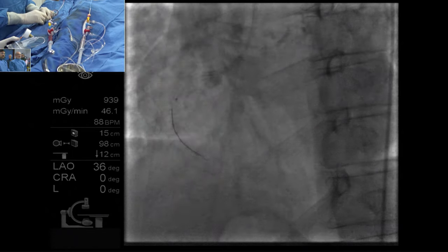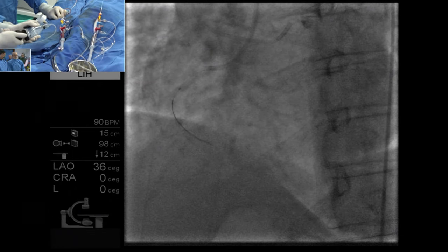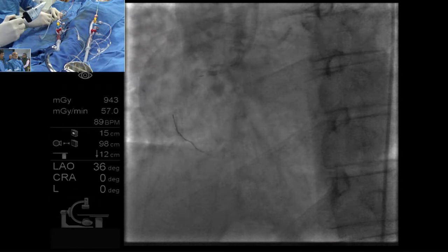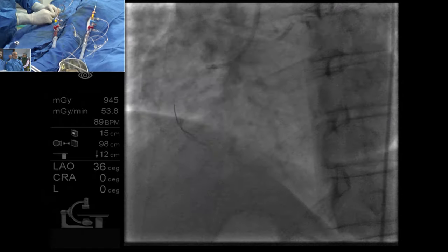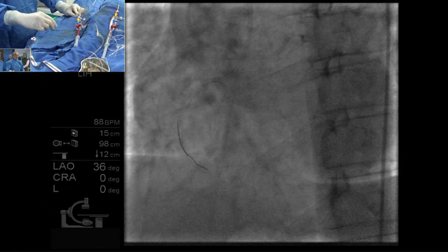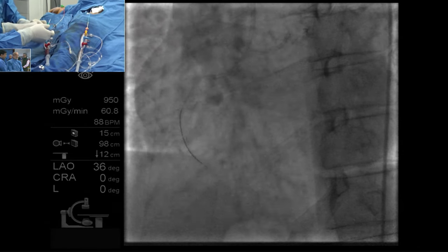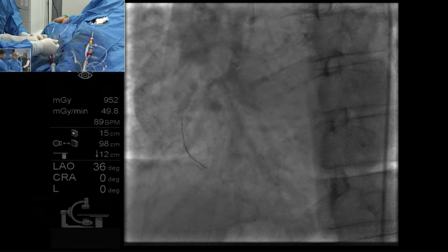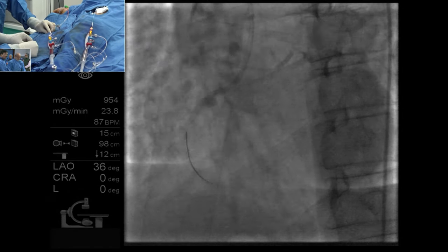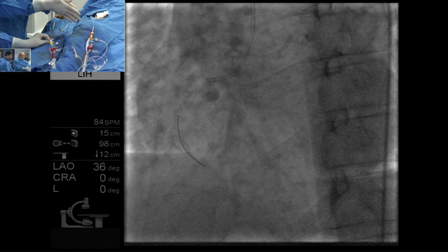Dr. Akasaka, the Tornus is a manual rotator, similar to the manual rotator, rotating gradually to rupture the stenotic lesion. So it's one of the options in these severely calcified lesions. Yes, and there's similar technology, like the Turnpike Gold, which is like a Tornus but narrow caliber, with a screw tip. If you can wedge it into the lesion, it will screw through. Like a mini Tornus. These are very helpful catheters.